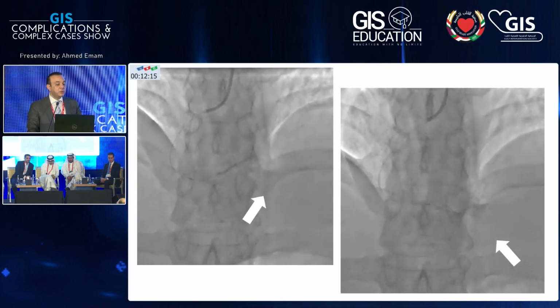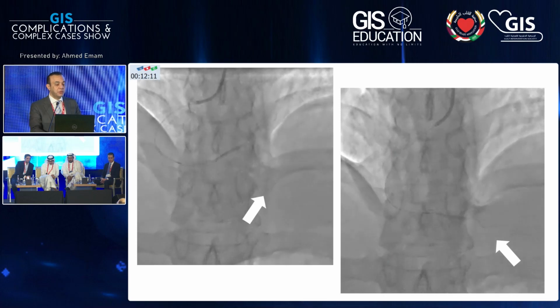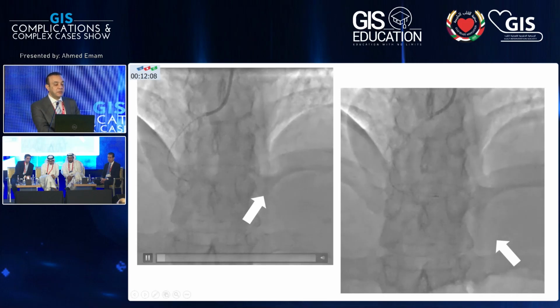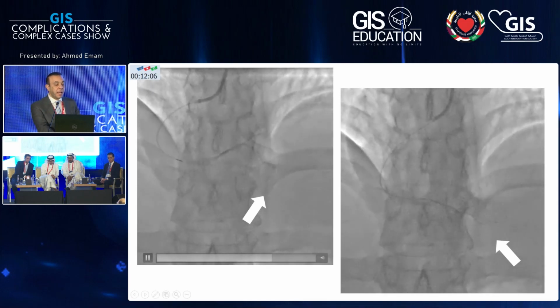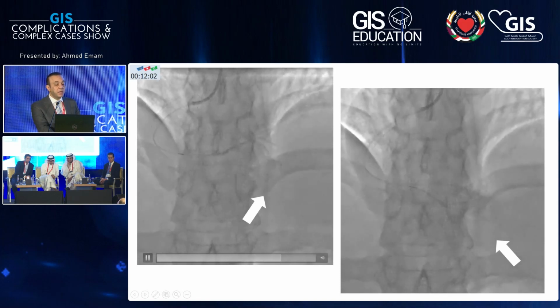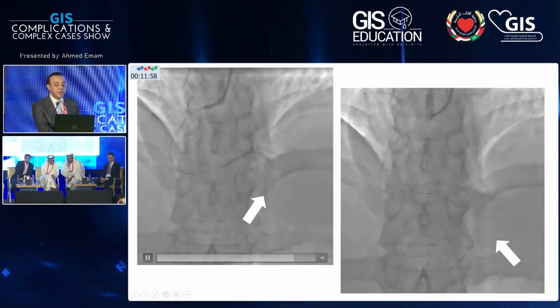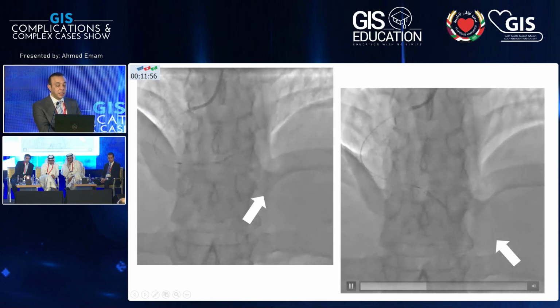After that, my routine, to try to get the microcirculation or no reflow out of the equation, is to go distally, as you can see here, with the microcatheter past the occlusion, and I selectively injected directly inside the PLV and the PDA here on the right side.